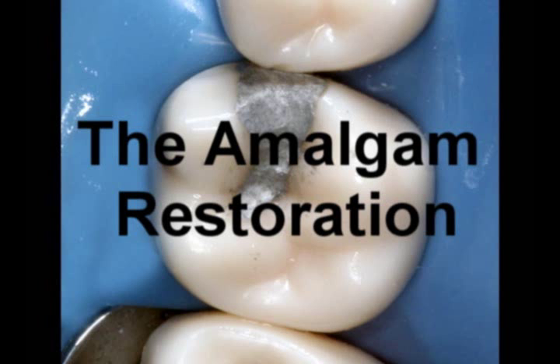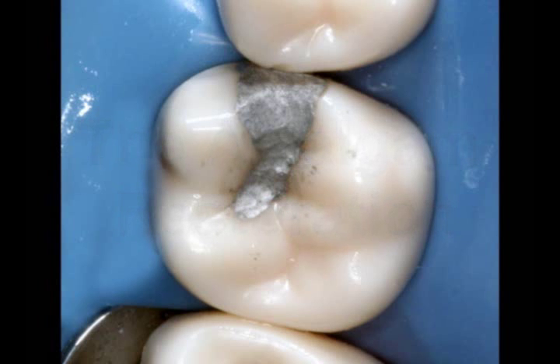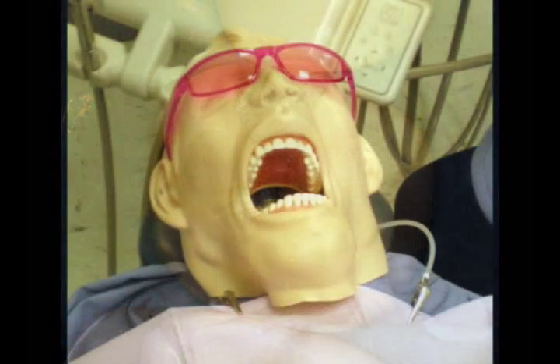This video shows the restoration of tooth number 3 with an MO amalgam. Dextra will be used during our procedure.